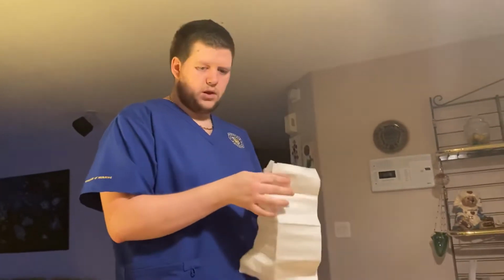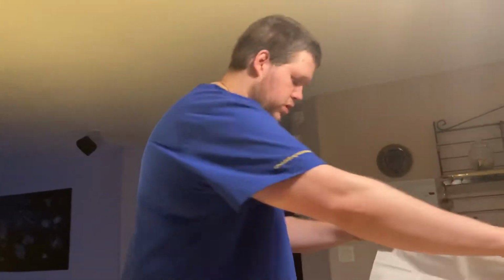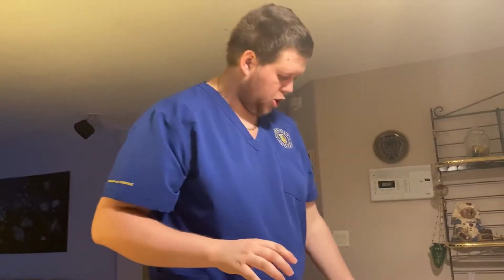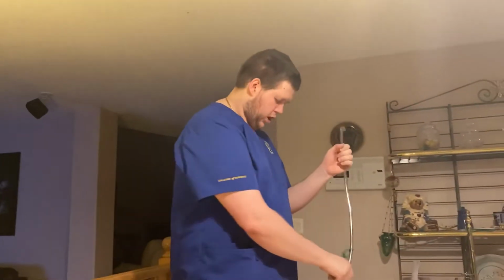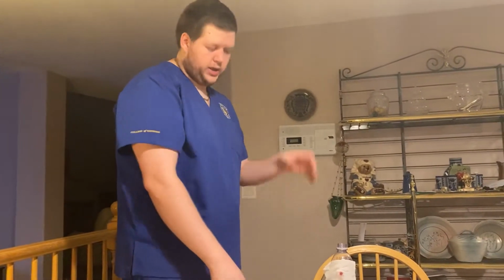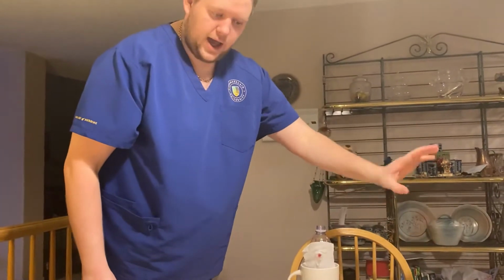I would raise the bed, raise up the patient, close the curtain for privacy, lower the side rails, and then set up my drape. Then I would make sure all my suction is set up. My suction would be at 100 to 120 continuous, and I would have an ambu bag here at 12 liters or the highest it'll go. And then I would put a pulse ox on the patient.